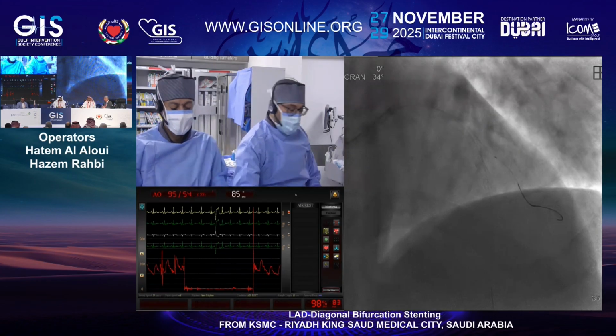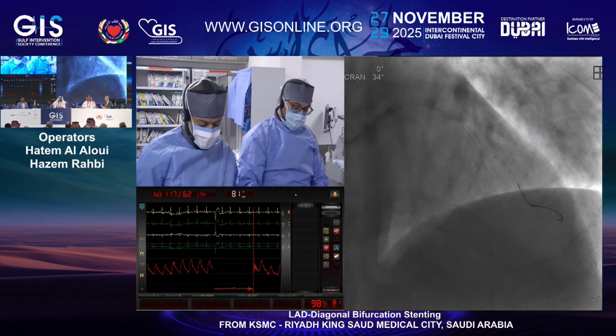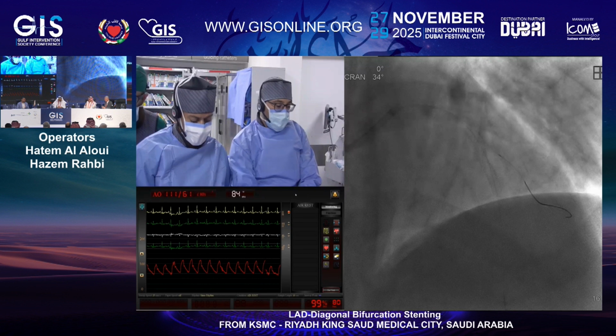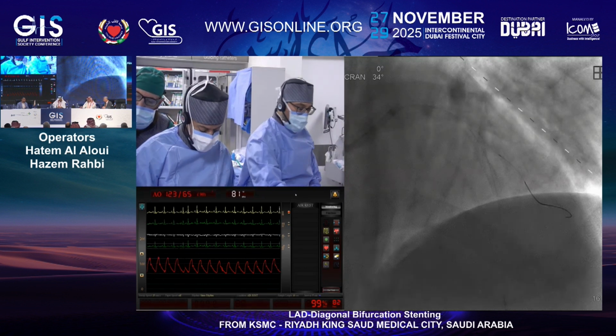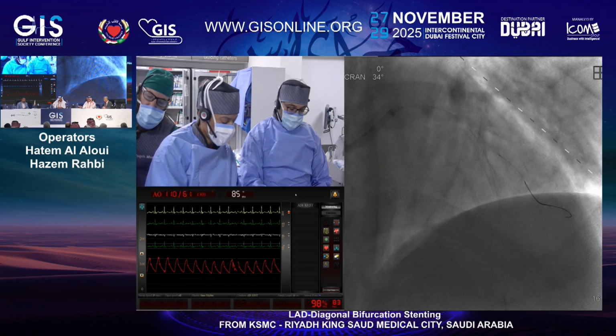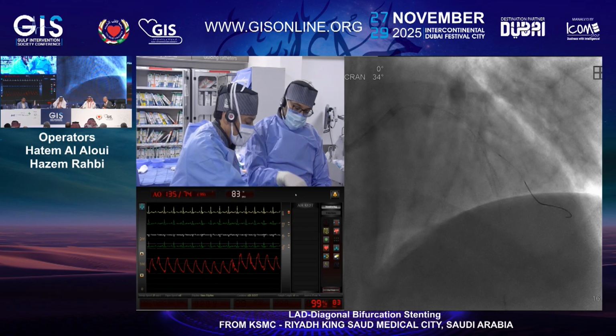So it's really important to have IVUS both before and after to check the optimization of the stenting. Yes. And even the new data in the literature show that imaging in bifurcation lesions makes a big difference in preparing, making your decisions, and checking your stent position after you finish.